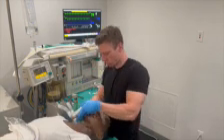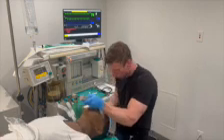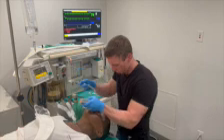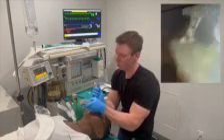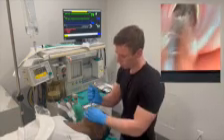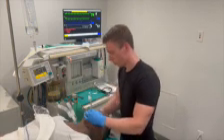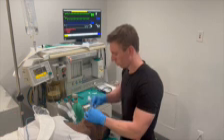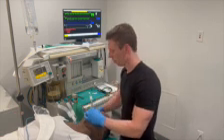When placing the laryngoscope into the patient's mouth, focus on keeping your wrist in a fixed position, your elbow in, and imagine your wrist moving toward the opposite end of the ceiling. Hold the ET tube toward the distal end and insert it into the larynx at the 3 o'clock position. Once you have successfully passed the vocal cords, remove the stylet. The ET tube should be advanced approximately 2 centimeters past the vocal cords. The cuff of the tube is then inflated to the appropriate 25 to 30 centimeters of water.